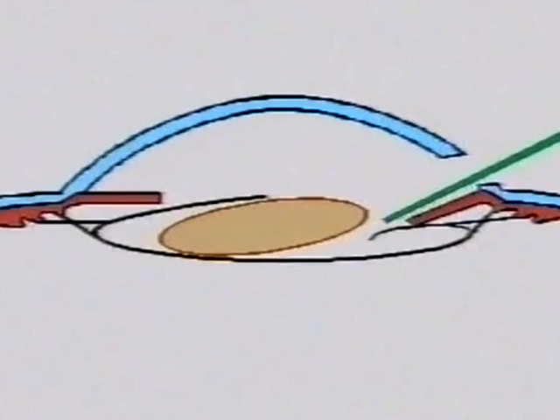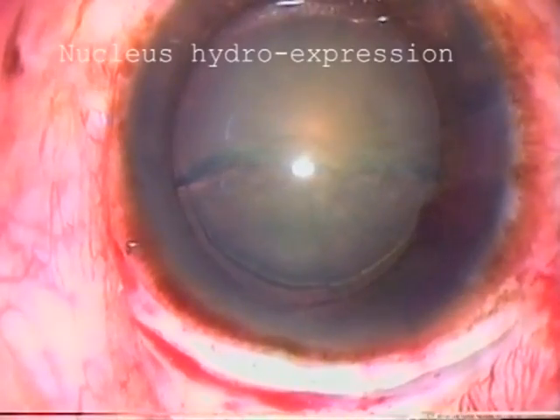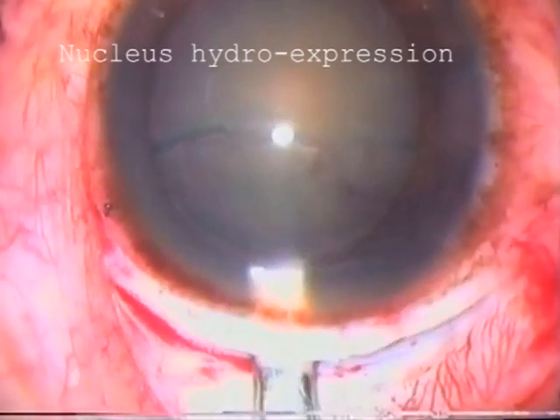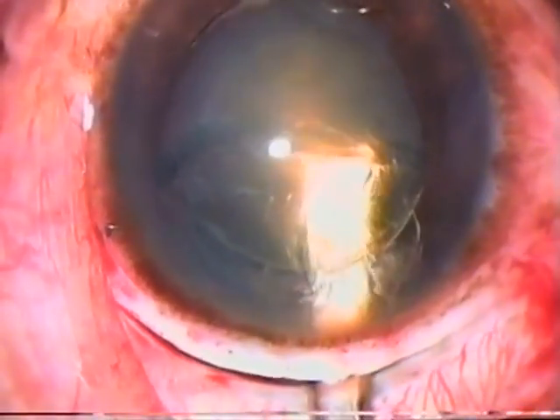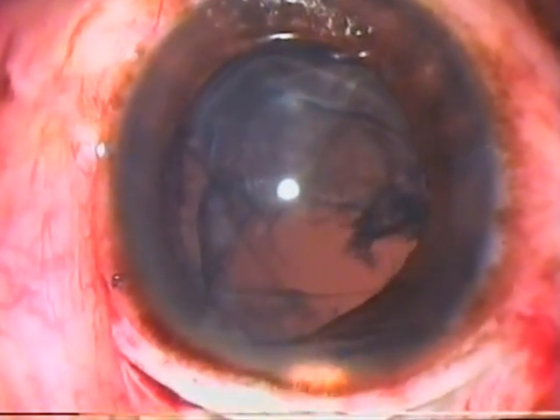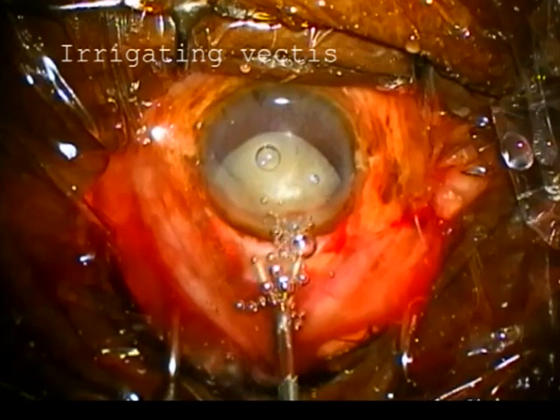An alternative to bimanual expression is to express the nucleus from the eye with forceful irrigation of fluid. As the fluid is injected, the nucleus floats out of the eye. This can be done either with a cannula or an irrigating vectis, which is placed just behind the nucleus in front of the posterior capsule. It is important to inject the fluid continuously to avoid damaging the posterior capsule. The loop rests just behind the nucleus pushing neither up nor down, and the shaft presses backwards on the posterior tunnel wall, opening up the tunnel.